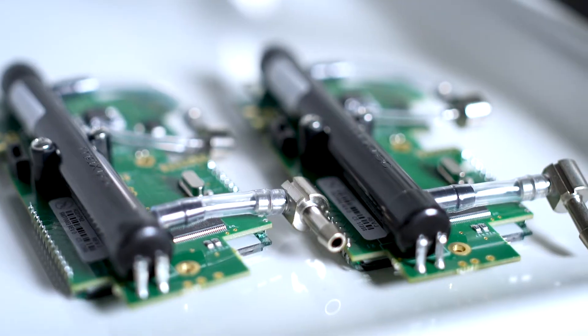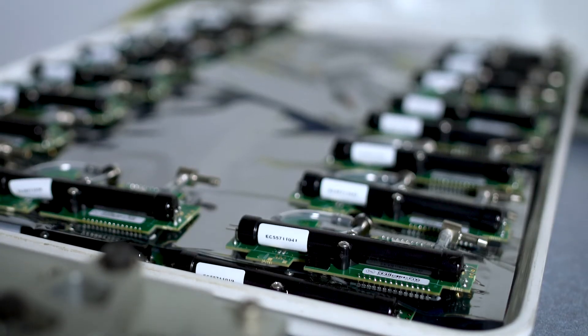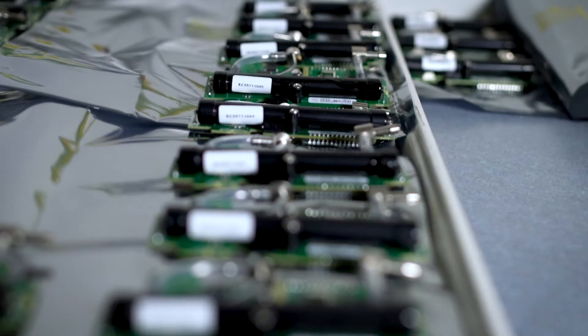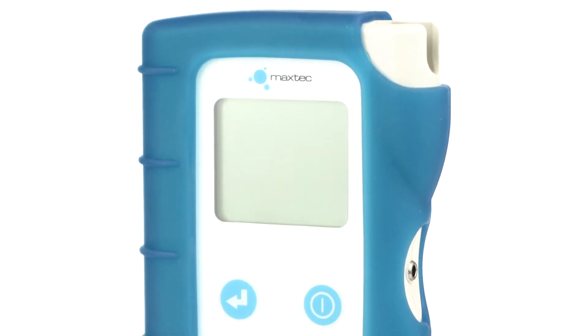With the Ultramax O2, you don't need to worry about taking the time to replace oxygen sensors, because there's a built-in ultrasonic oxygen sensor that's designed to last the lifetime of the analyzer. The Ultramax O2 has versatile measurement ranges for the oxygen, flow, and pressure to provide the utmost accuracy.